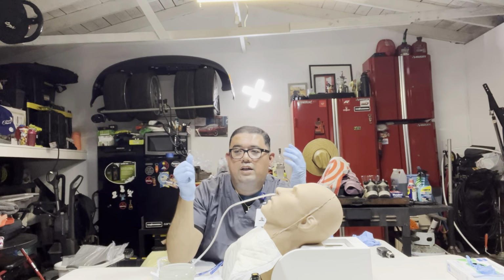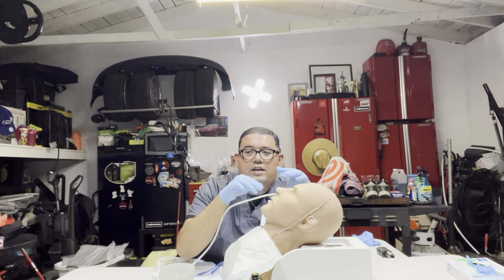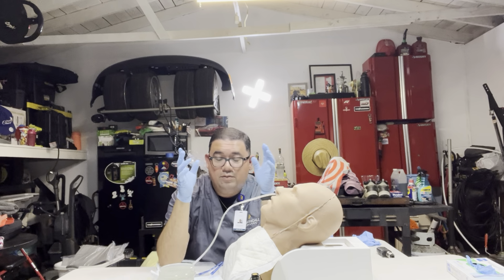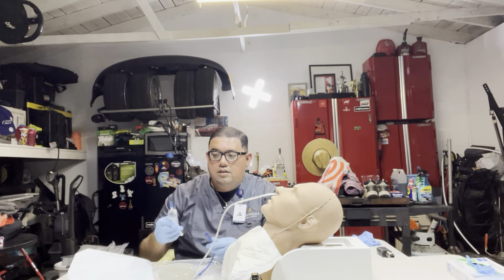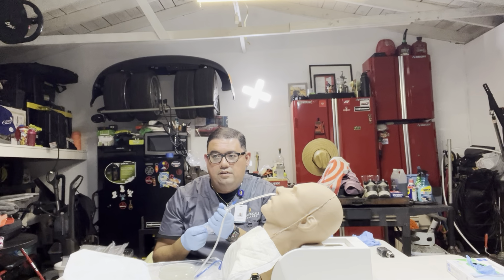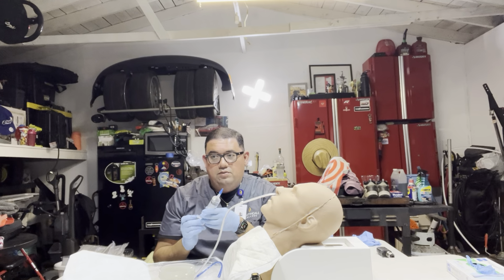Patient tolerated very well. So now I'm gonna go ahead and tape. I'm gonna check for placement by getting my piston syringe, with the little adapter connected right to the end. A lot of facilities have their own policy, so I would check with them what their policy is.